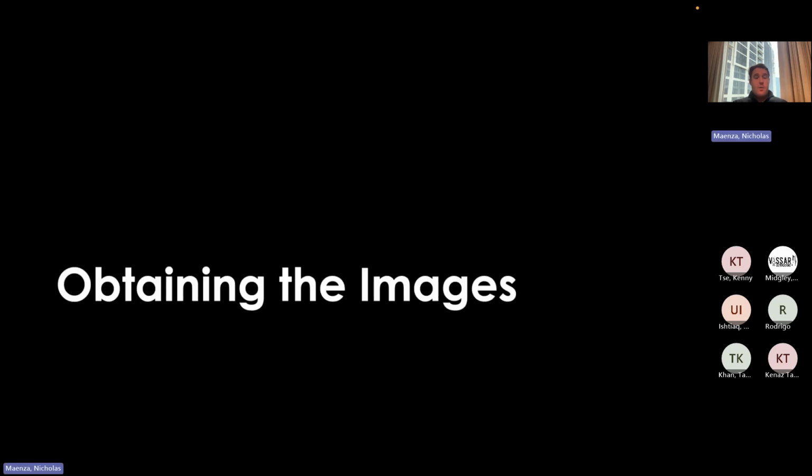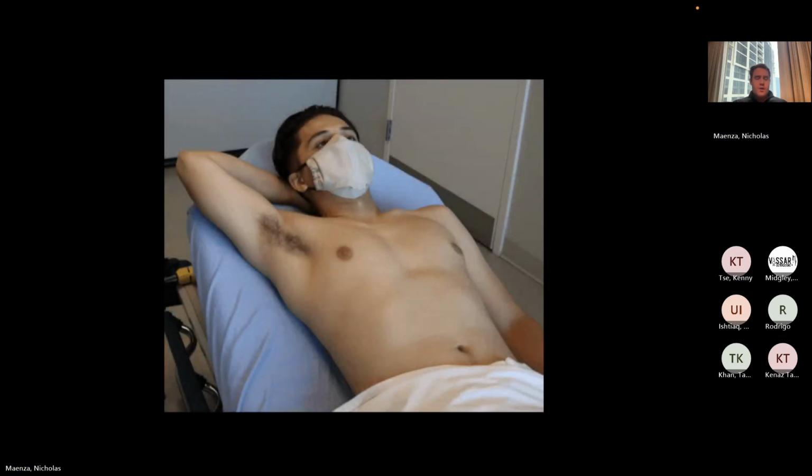All right. So how are we going to actually perform this ultrasound? There's a couple different ways to do it. I'll talk about, for the most part, the different protocols, the different stepwise approaches to do it. For the most part, we're going to be in the ER. You're going to be ultrasounding people who are laying on a stretcher. So you're going to have the patient laying down. They could be sitting up, but for the most part, just laying down.